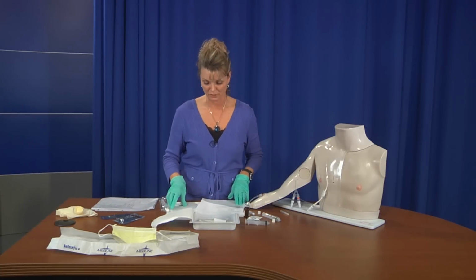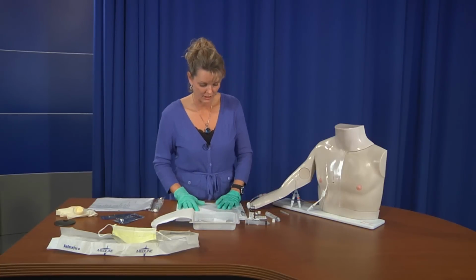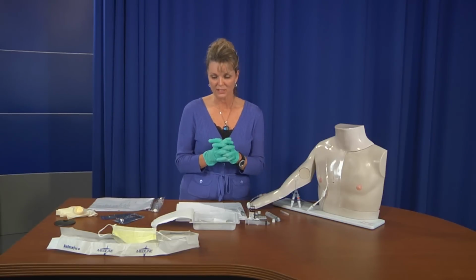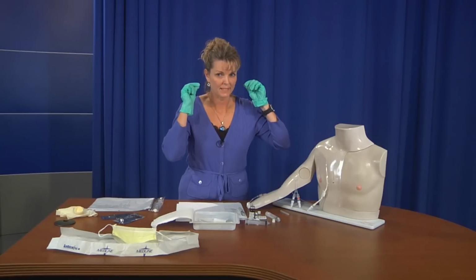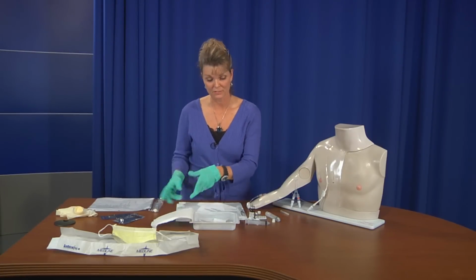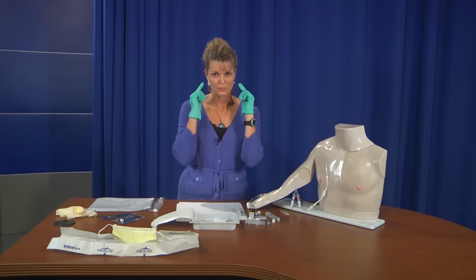So let's go through that one more time just real quick. I just want to make sure that you have all the steps down. The first thing that you want to do for your dressing change is wash your hands, right? Get all the germs off. The next thing you do is apply your gloves. The next step is to apply your mask, and that's where people tend to go wrong. You want to put your dirty gloves, or the gloves that you're going to be taking off your dressing with, on, and then you put your mask on.